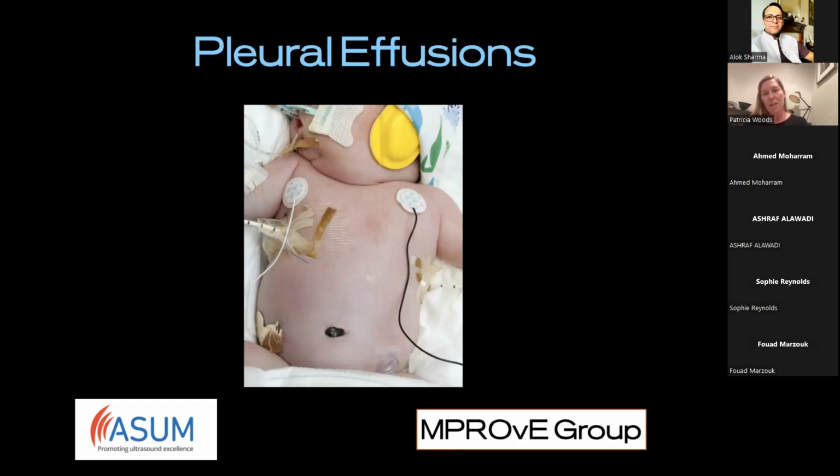So for me, using ultrasound here to assess adequate ET depth, making sure that you haven't got right upper lobe atelectasis, looking at the extent of effusion and collection, efficacy of the drains, whether there's troubleshooting, whether they're dislodged or blocked. And again, looking at diaphragm movement and the actual lung artifacts underneath, of how congested or compressed these lungs might be, and the impact. This little one was with us for a good 3 months and did brilliantly with the team.